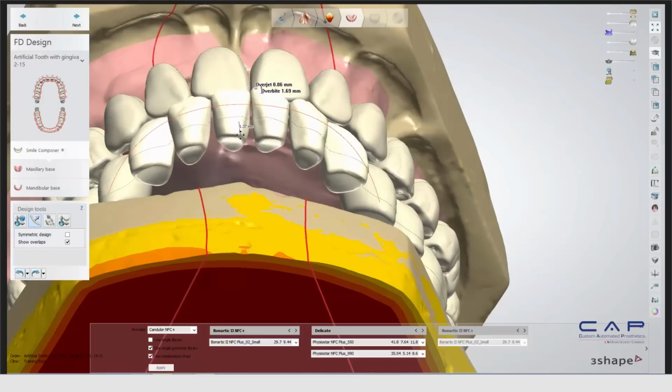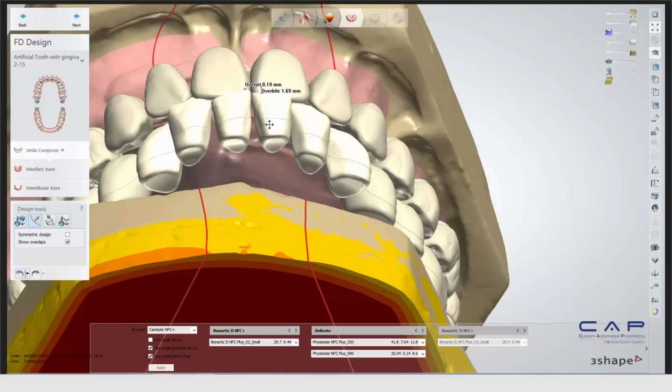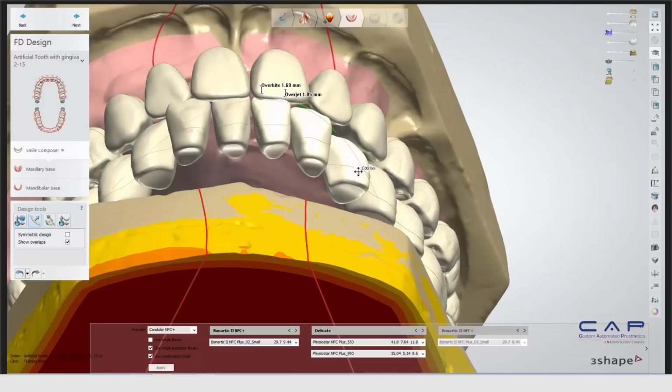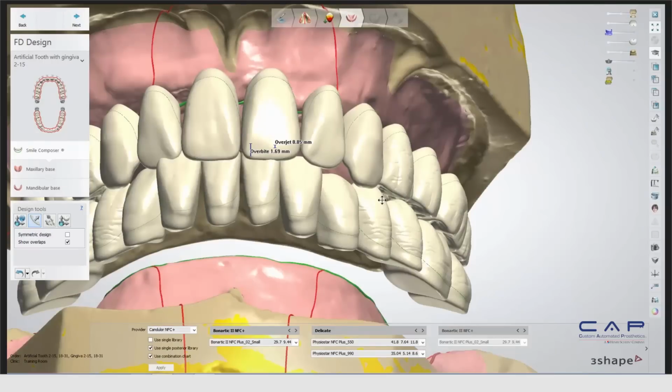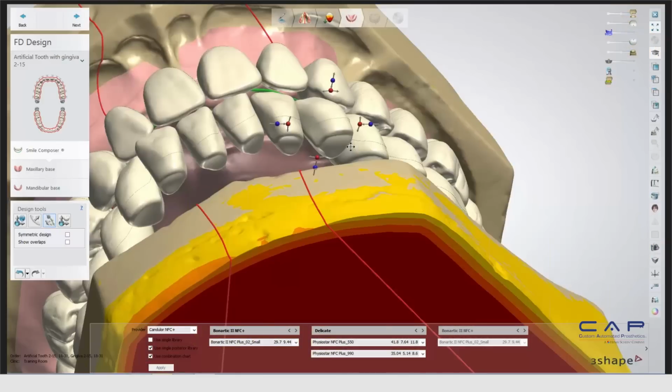So if we want to kind of pull these in, we can go ahead and pull the anteriors lower in a little bit, just to kind of adjust this setup. It is a little tricky to get used to because these units do want to snap back and forth with each other, but you just kind of have to work across this unit. Once you have the teeth set up, you can then move on to the next one, which is the manual arrangement, where you can arrange individual teeth, kind of does symmetry along the instances, or you can turn that off. And here we can kind of rotate the individual teeth or move them into individual positions. So it allows us to kind of customize the setup of the teeth a little bit better.